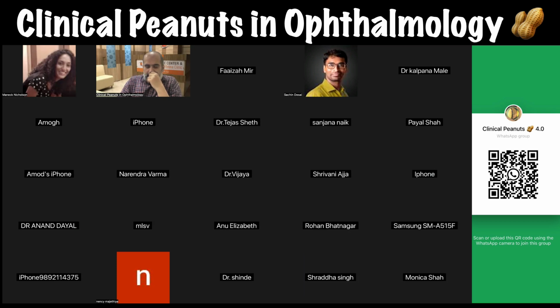And if we get the IOL Master 700 for this calculation, do we still need topography also to rule out an irregular cornea? If you're not expecting that it's very irregular, there's no reason for you to suspect anything irregular, then no need.